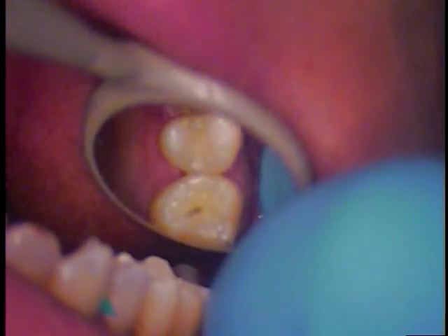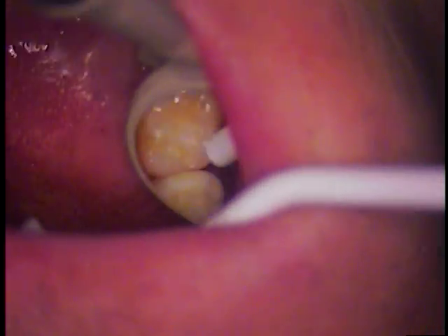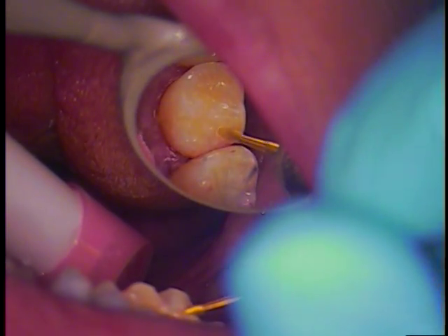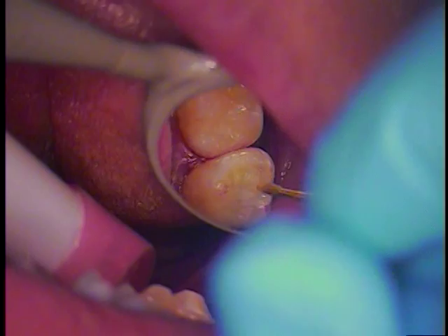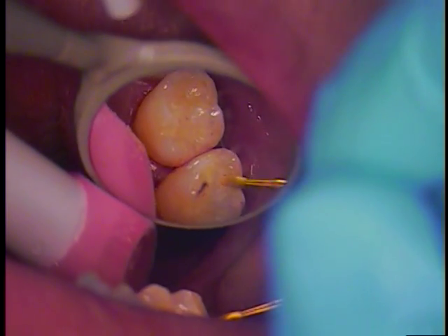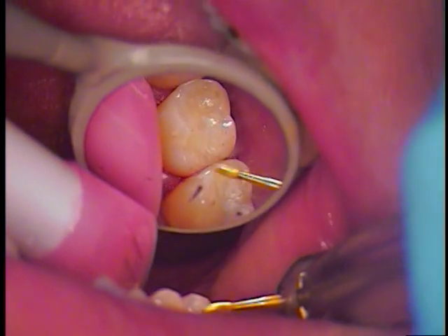All set for articulating paper - I'll dry it. Paper in please. Okay, close all the way down, tap tap tap. Let's see where we're hitting. Okay, so we got an incline here, a little incline right there, a little something right there. Paper ready again, tap tap tap - good. Back molar still hitting; high spot - round this a little bit.